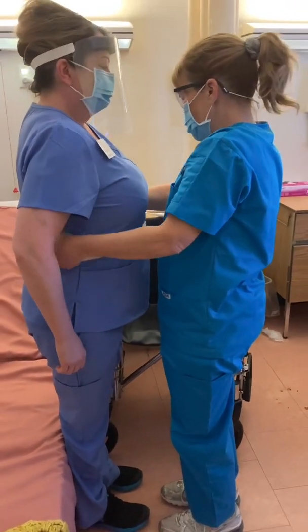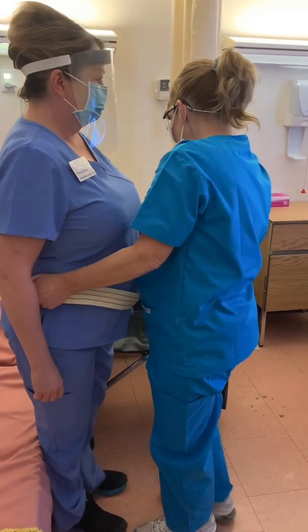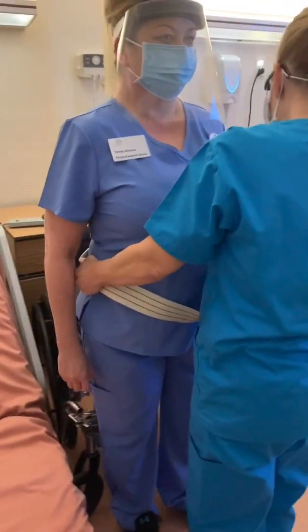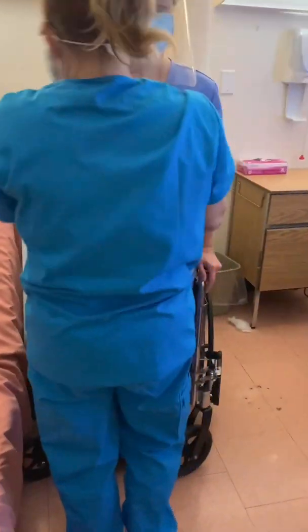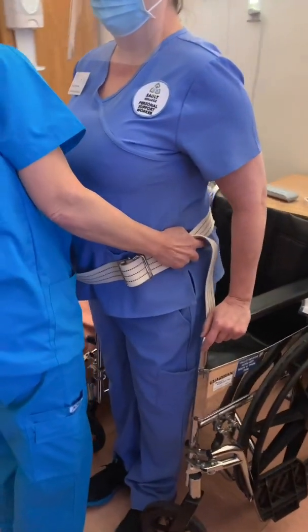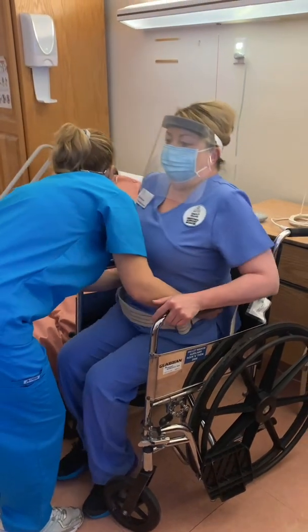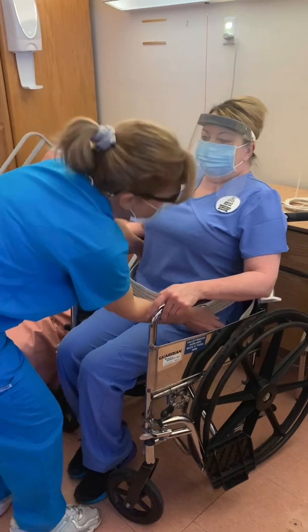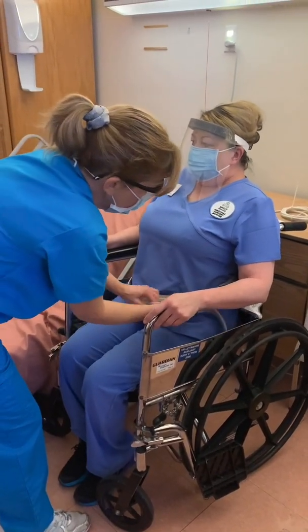No. Okay, so what I'm going to do is get you to pivot slowly so that the back of you is facing the chair. That's it. And if you could just step back and see that your knees are near the edge. Exactly. So on 3, I'm going to get you to slowly sit in the chair. 1, 2, 3. How's that? Fine. Now, are you able to push your bottom a little bit further to the back? Yes. There you go. So I'm going to just remove this.